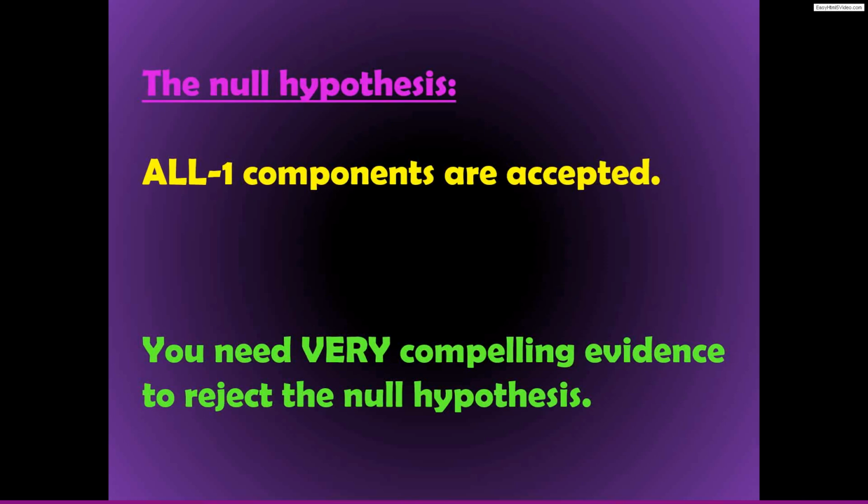The reason why this is the case is that most often the components are mixed with signal and noise. So the ICA is generally not perfect at really nicely separating the noise from the signal. Most of the time you will see components that contain something that looks like real brain signal and also something that looks like noise. And so this is where things get tricky.